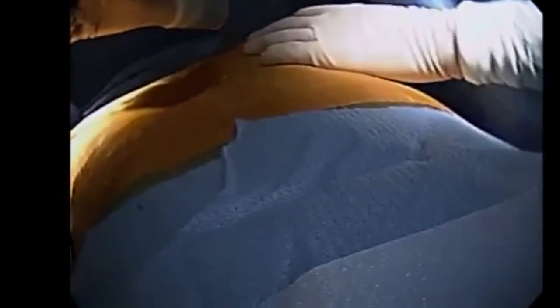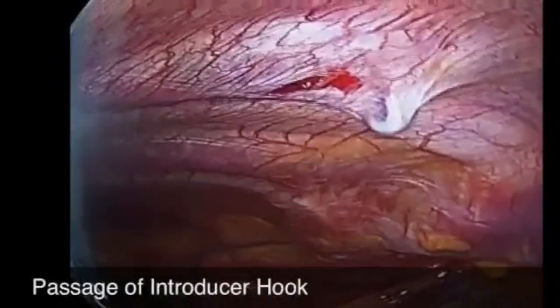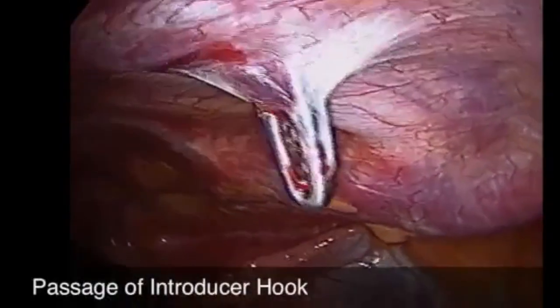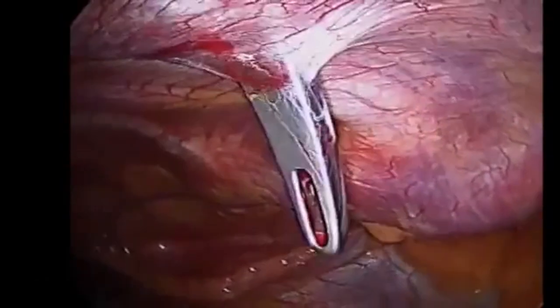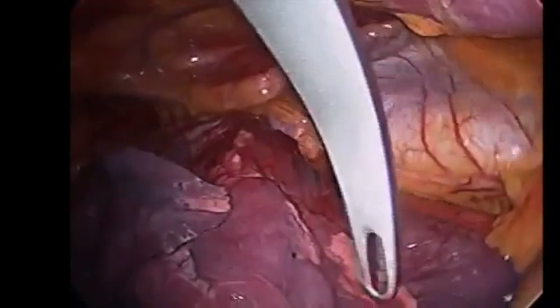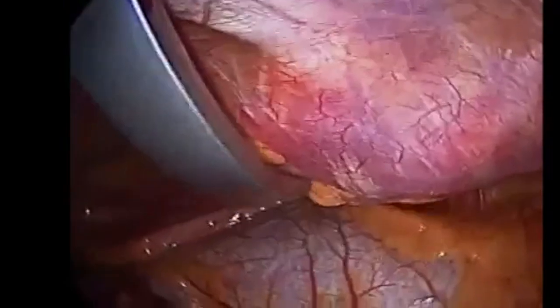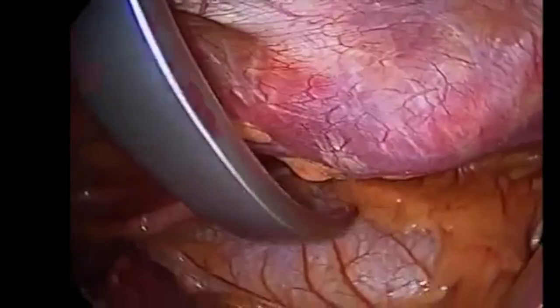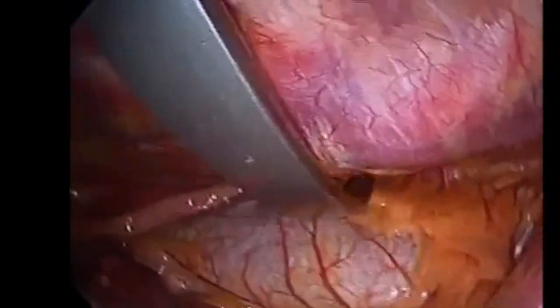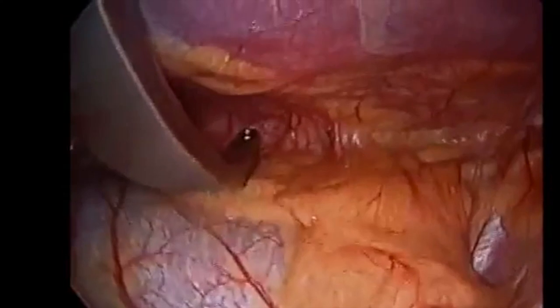A small lateral incision was made and a subcutaneous tunnel was created to the inflection point of the right side of the pectus deformity. An introducer hook was guided into the right hemithorax under thoracoscopic guidance, and the beginning of the anterior mediastinal dissection was performed.